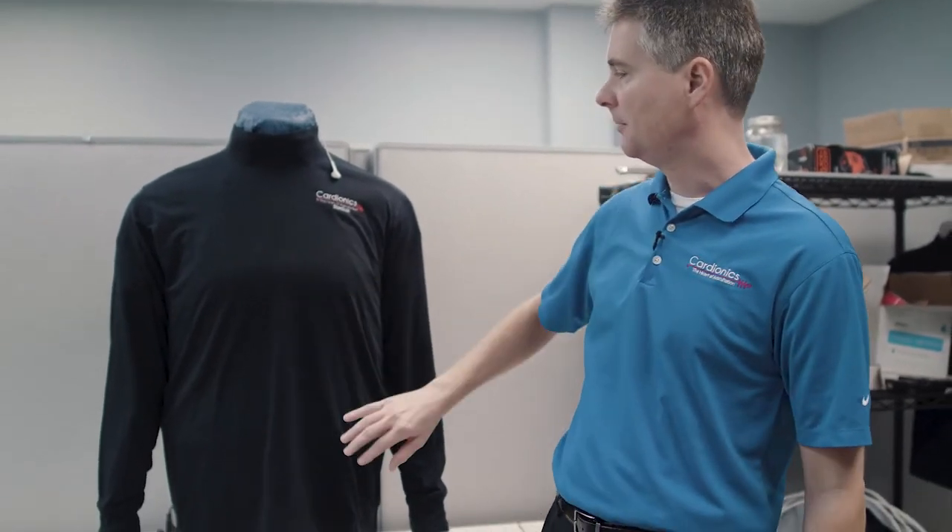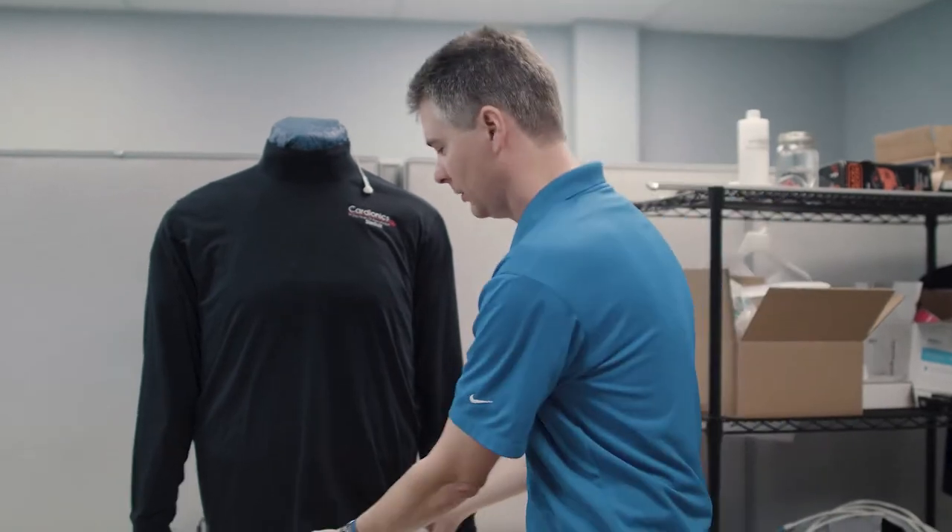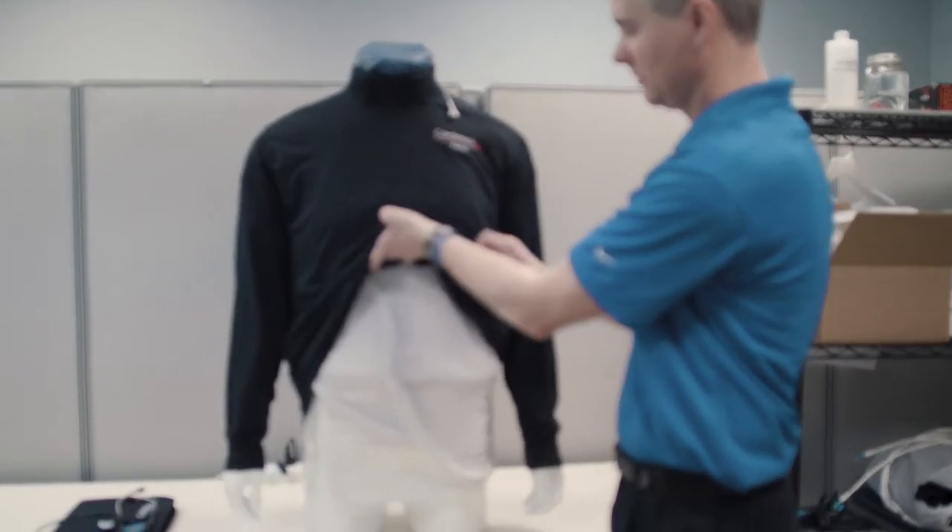This is the final product here, all put together. We have an overlay shirt that covers everything up. If you wanted to get to the ECG, all you have to do is pull up the shirt to get to the ECG snaps and just snap on your ECG leads.